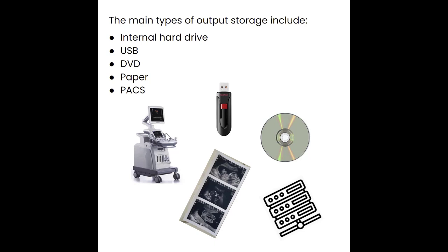Typically, after you finish an exam, you end the exam, and that exam is saved directly into the internal hard drive of the machine. Now, the internal hard drive of the machine is limited. The machine will self-delete exams after a certain number of weeks or when a certain amount of storage has been taken up. Usually, there's enough on there for at least a few days' worth of exams, depending on how many cine clips and all that you're taking.